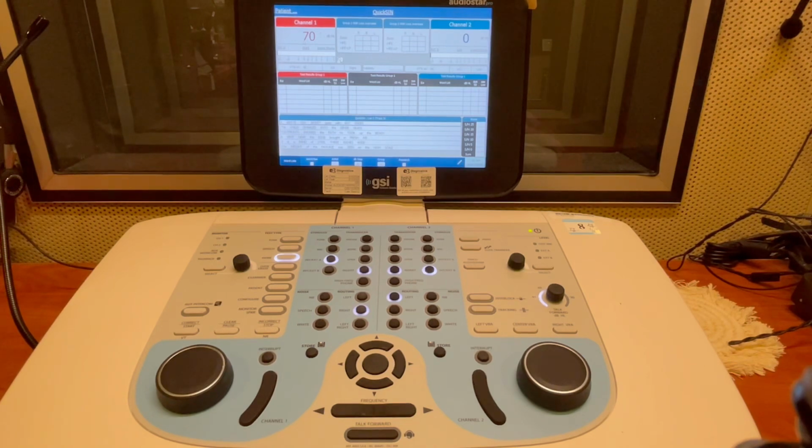For auditory processing dysfunction, it's a test of monaural low redundancy. So we're going to do it in each ear individually. Clinically, a lot of clinicians do the test binaurally, but we need to do two lists. The word list will start as the practice list. I have changed my settings on the audiometer so it starts as track 3 or list 1.